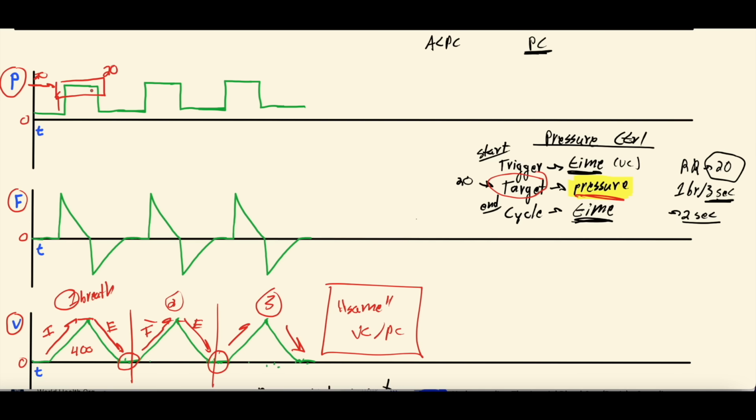Then when the breath's done, it drops back to not quite 0 here, because this is the PEEP, which we talked about in that other video that we mentioned, the introduction. So we won't go into it here as much. But every breath, right? So that's breath 1. Breath 2, it goes straight back up to that inspiratory pressure of 20 you set. It leaves it there for the whole breath, and then it drops back down to the PEEP. That's breath 2. Same thing for breath 3.